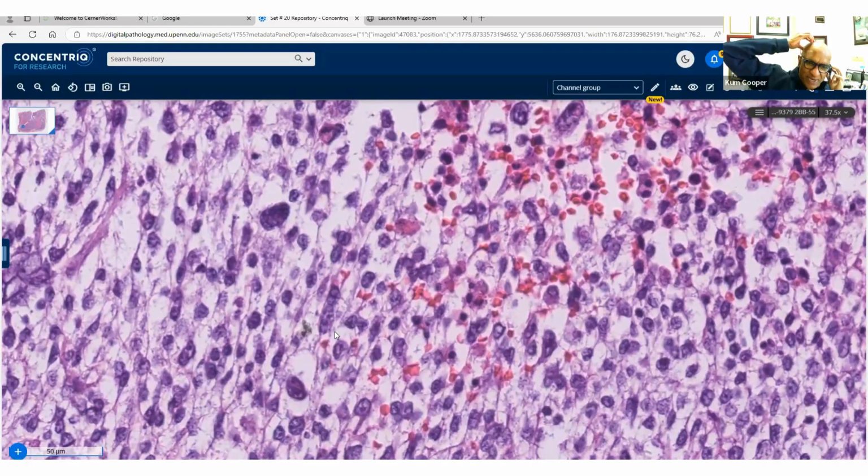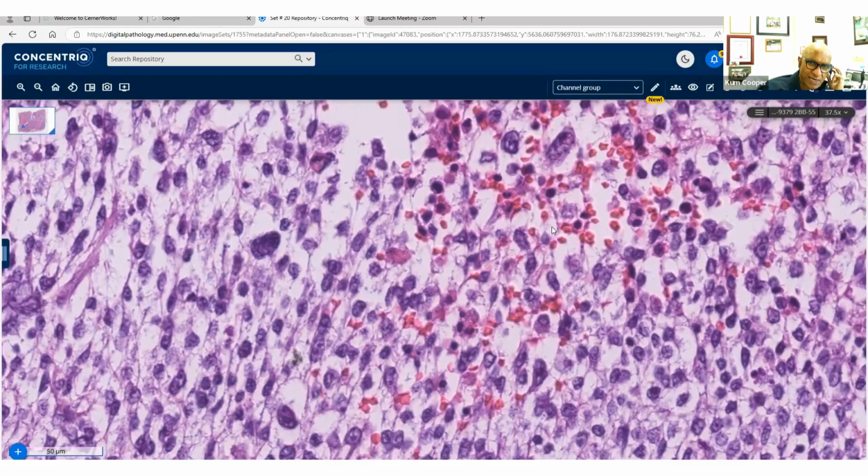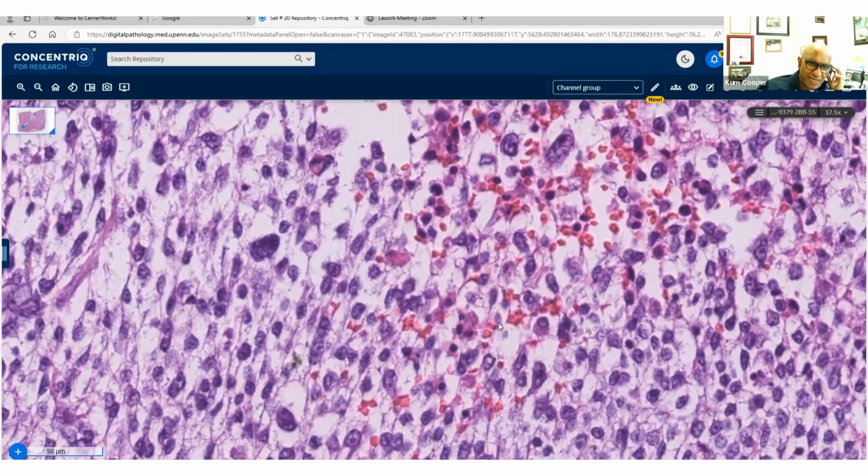And that's why I was placing the emphasis on morphology, because when you see a few of these, you begin to pick them up and predict that they're going to be the CIC, the fusion gene being DUX4. So Ewing's does come to mind. And then when you see this nuclear pleomorphism, I want to show you these large nuclei coming up here, which is useful. They tend to have this clearing, but not all of them do.